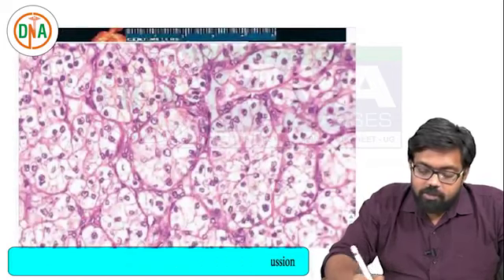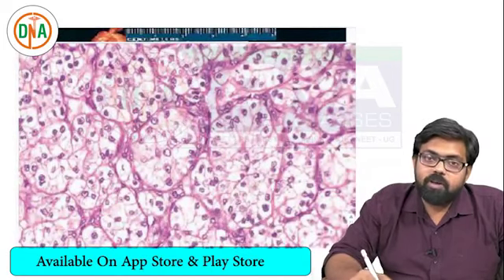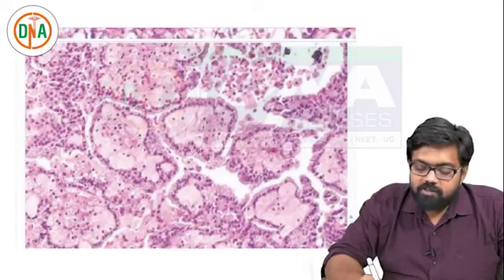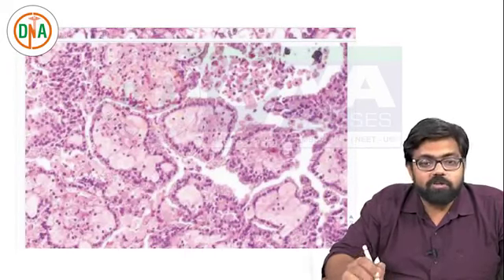Next, this is the image showing a clear cell. This is the most common histological type, clear cell carcinoma. And next one is the papillary carcinoma, the papillary variant of RCC. Sometimes you also come across psammoma bodies here.